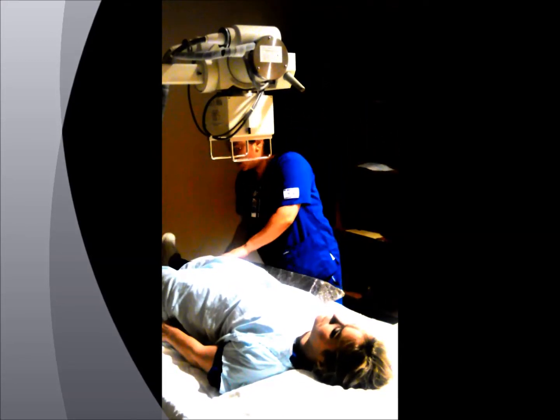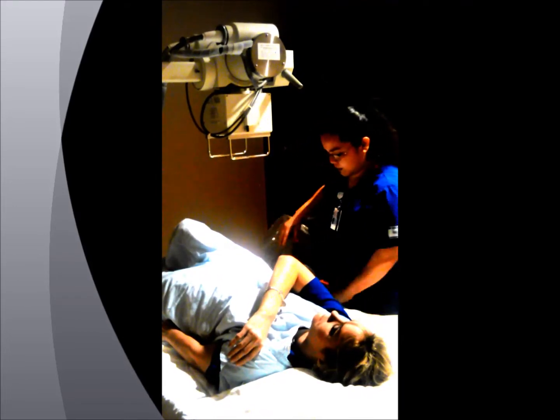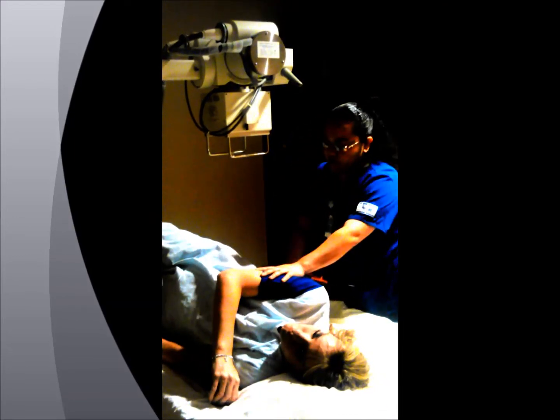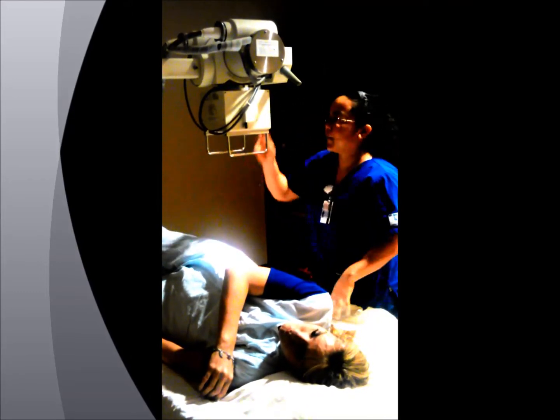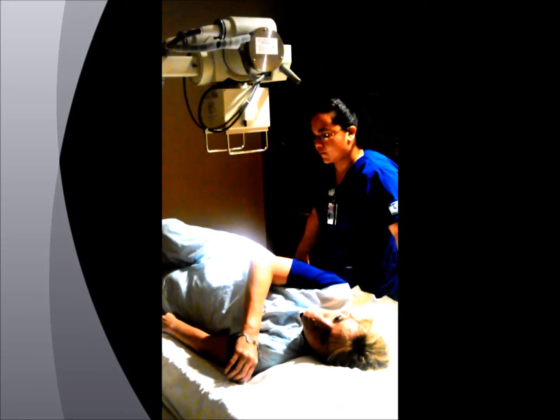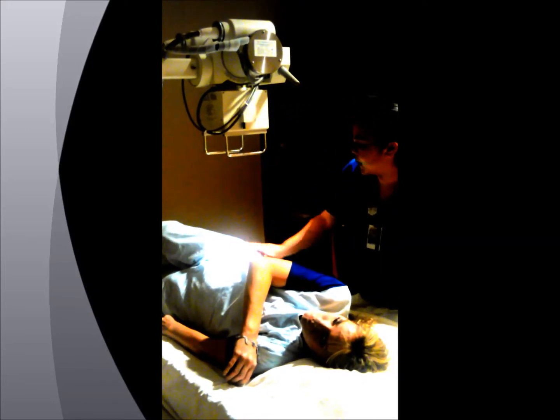You want to make sure that they are aligned. You want to have the patient pick up their knee and have their arm reach across their chest to ensure equal rotation of the hips and shoulders. You want to use a radiolucent sponge so you can have your patient at a 45-degree oblique. You want to make sure that your patient is centered midline of the table.